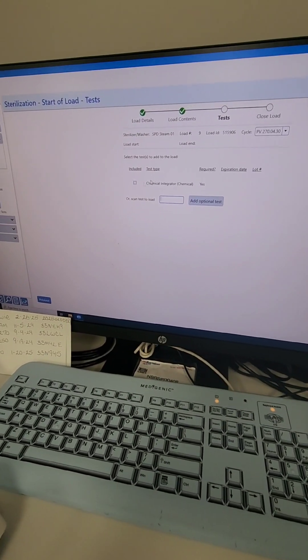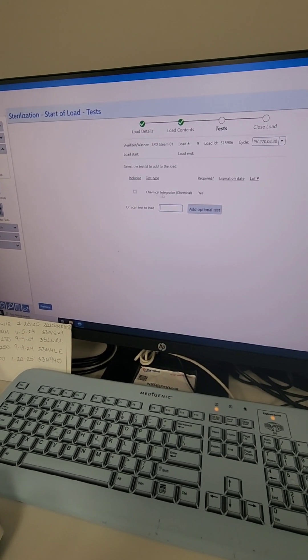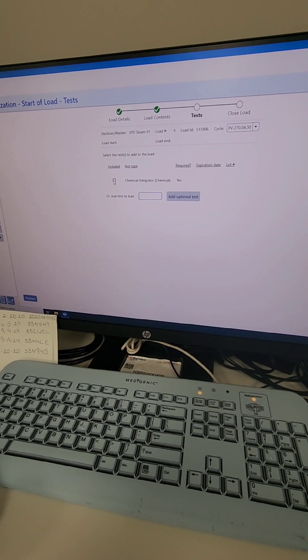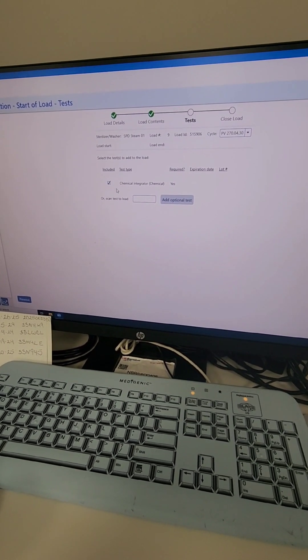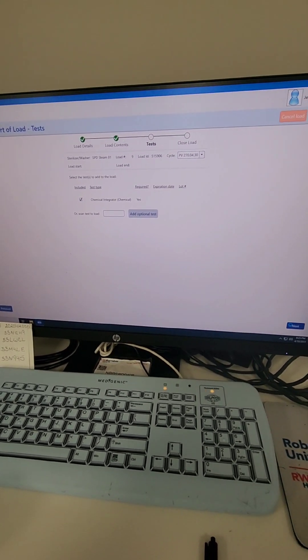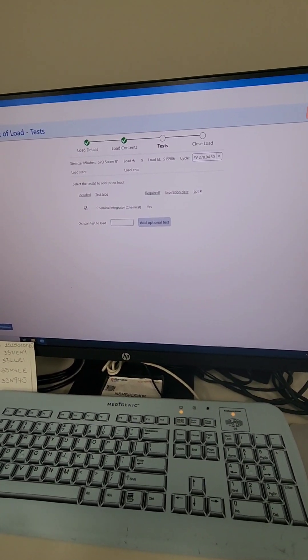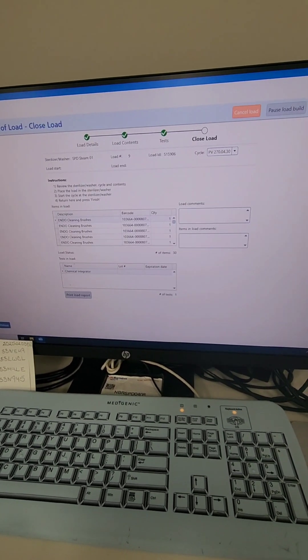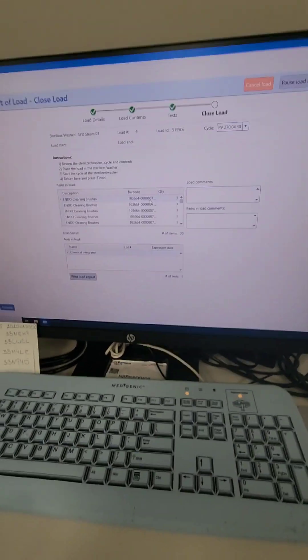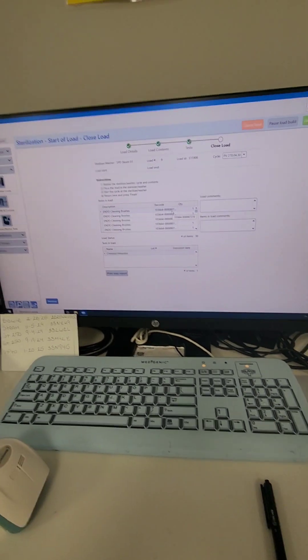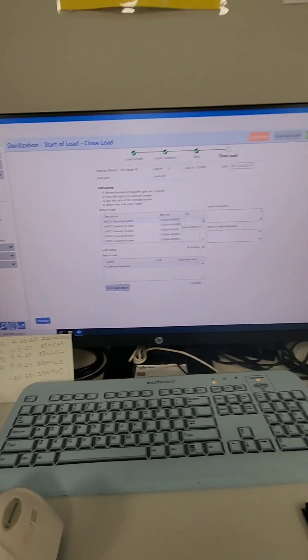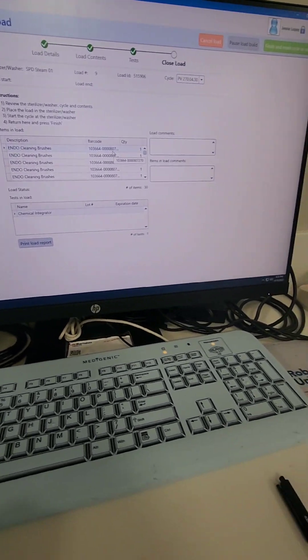Go ahead and hit next. For the test we do for load releases, we place a chemical indicator in there — I'll check that off because the chemical indicator is placed. Hit next, and this is my summary screen right before I put it into the sterilizer, showing me everything that's in the load.